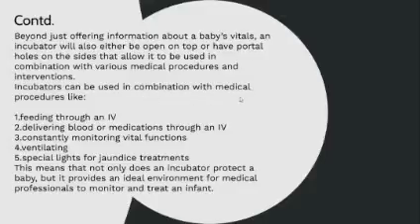Incubators can be used in combination with medical procedures, for example, feeding the baby through an IV because he or she can't eat food or drink milk. Delivering blood or medications through an IV because we cannot puncture the baby every time we have to deliver any medication. Constantly monitoring vital functions because the baby is not in stable condition, so we need to measure it from time to time. Ventilation, special lights for jaundice treatments.